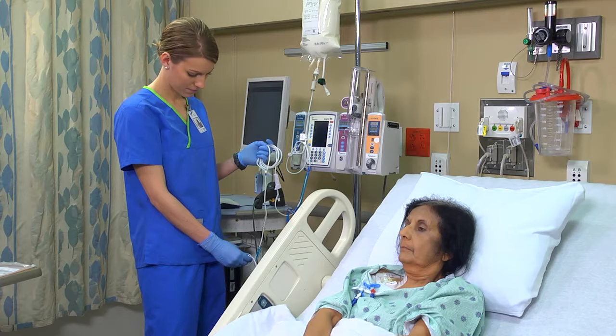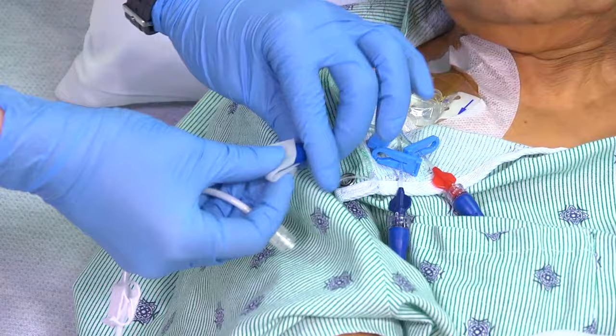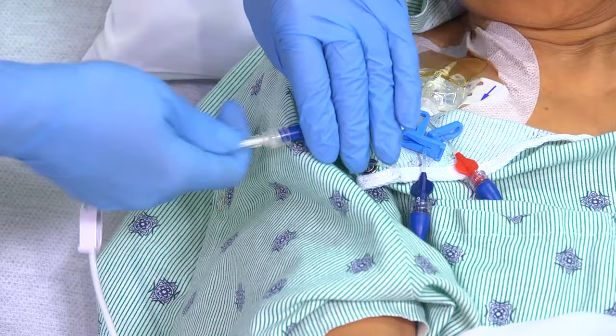Allow the solution to run into the trash receptacle to clear the line. Then use the roller clamp to turn off the flow. Use an alcohol swab to clean the correct port. If a dedicated port is not available, flush the port with a syringe filled with normal saline to clear it of residue. Now connect the end of the tubing to the appropriate central catheter port and label it.